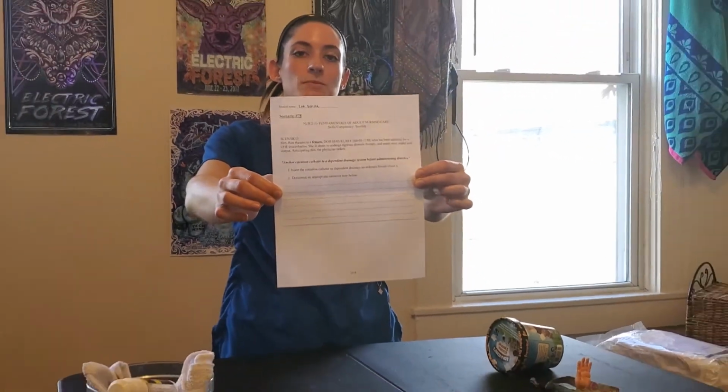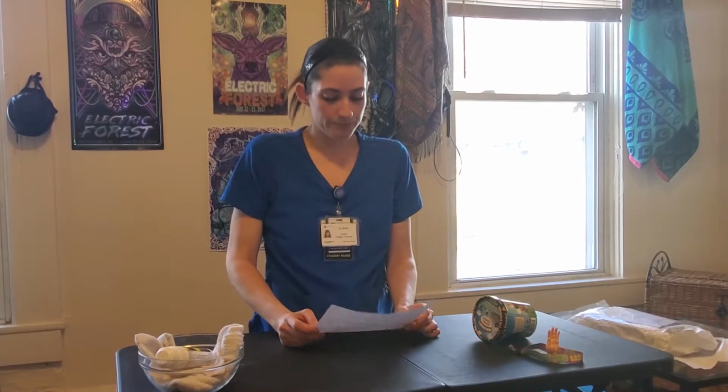Our patient is Mrs. Ren Harumi. Her date of birth is 03/03/83. Her patient ID number is 160011180. She's going to begin an intensive diuretic therapy, so we need strict I&O monitoring, which will require an indwelling Foley catheter with a dependent drainage system.